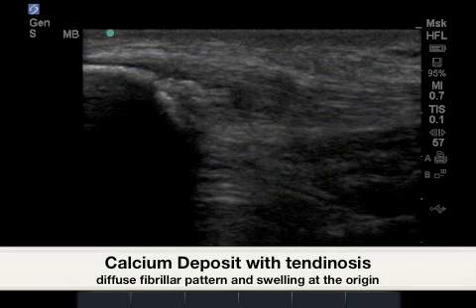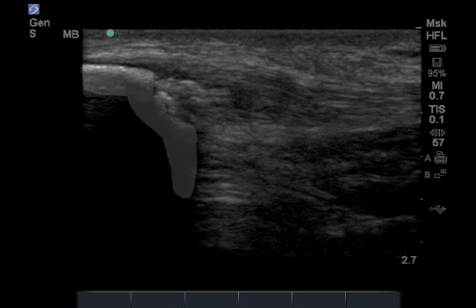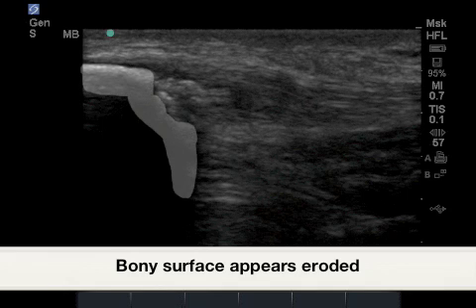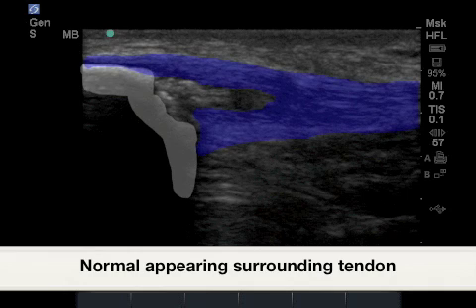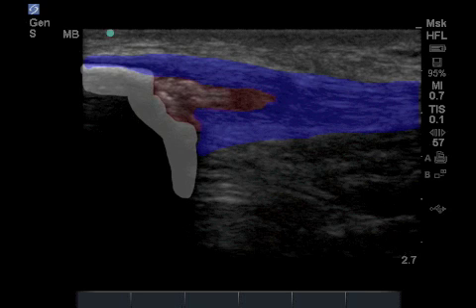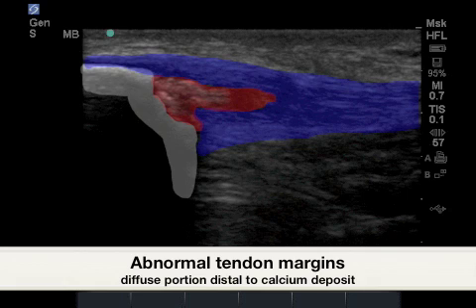In the next image, just millimeters over to the mid-sagittal line, we see a more hyperechoic insertion of the apex of the patella, which appears rigid. The blue represents the more normal intact tendon fibers, the red represents the calcified portion, and this is also followed by a tendinotic fibrillar pattern change.